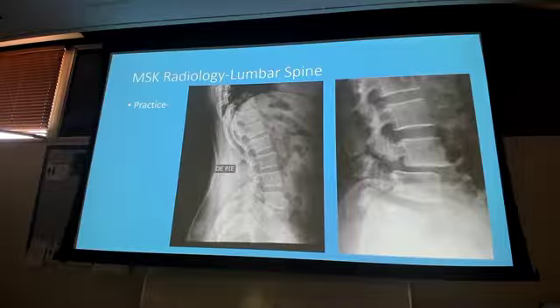Remember, don't let the shiny toy get you. And how do you know if I'm looking for degenerative disc disease or a spondylolisthesis? Read the question, read the answers, then figure out what I'm asking you to look for. Because finding x-rays is a little bit easier when we're looking at certain kinds of fractures that we've talked about, right? But when we're dealing with spine, and particularly next block with the chest, finding x-rays with just one abnormality is very, very difficult to do.